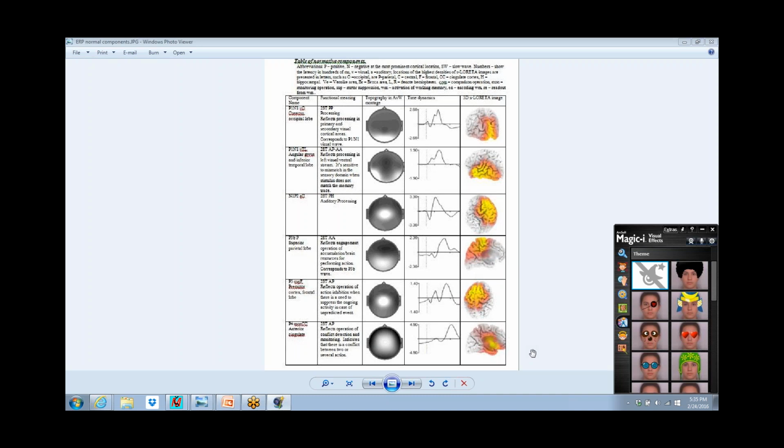The clinical yield on it hasn't been proven. It's been proven to work as a technique. You can feedback activity with LORETA and actually get feedback to occur. But there's nobody that's done OCD LORETA feedback specifically to show OCD is treatable with neurofeedback using LORETA. The ADD ADHD work has been shown to be good efficacy, but they don't have Z-score based feedback that's already gone through that level of proof as well.